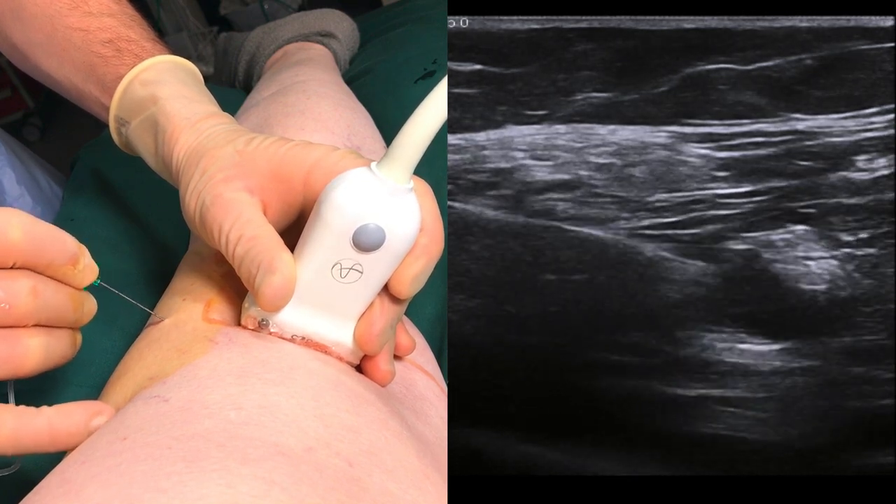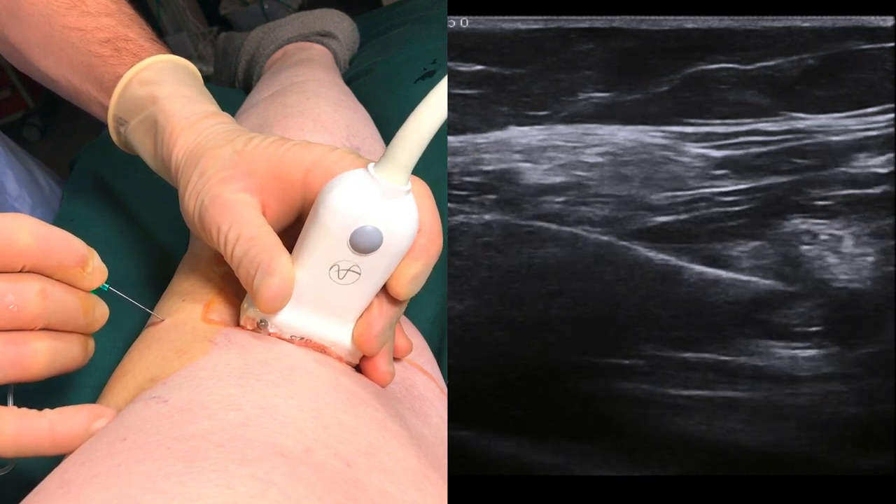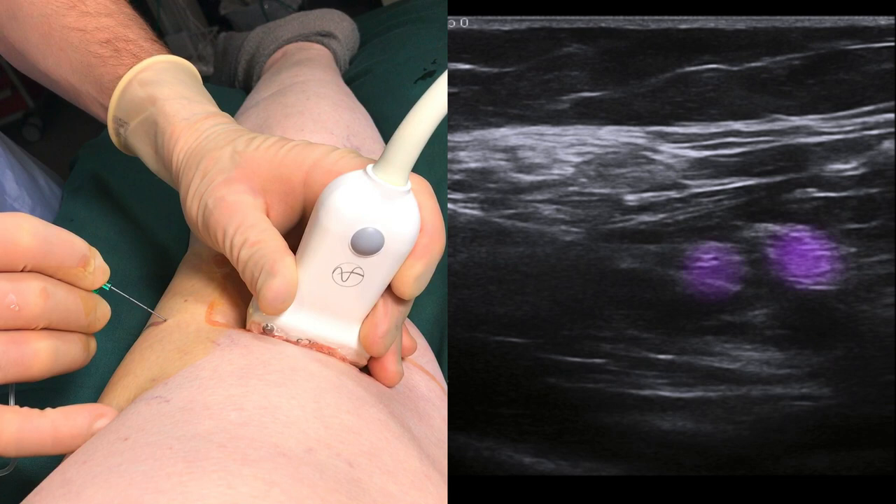Inject a total amount of 30 millilitres. This is usually enough to make the two branches, marked in purple, appear clearly in a void of local anaesthetic, marked in green.